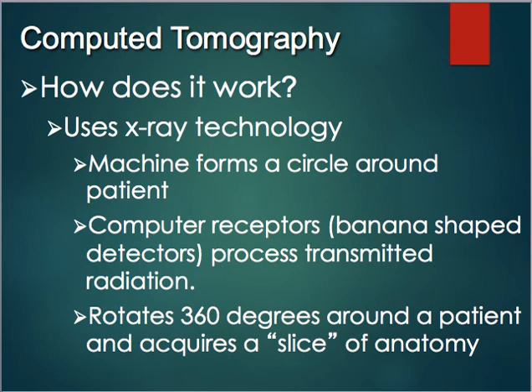So like I said, if you've got a patient who's very large, has a very large belly, they might not fit through the scanner. If you actually took that scanner cover off, and I'll show you in just a few minutes here in a future scan, inside is a rotating frame, which has an X-ray tube mounted on one side, and then that banana-shaped detector mounted on the opposite side. And they rotate in unison together around the patient.